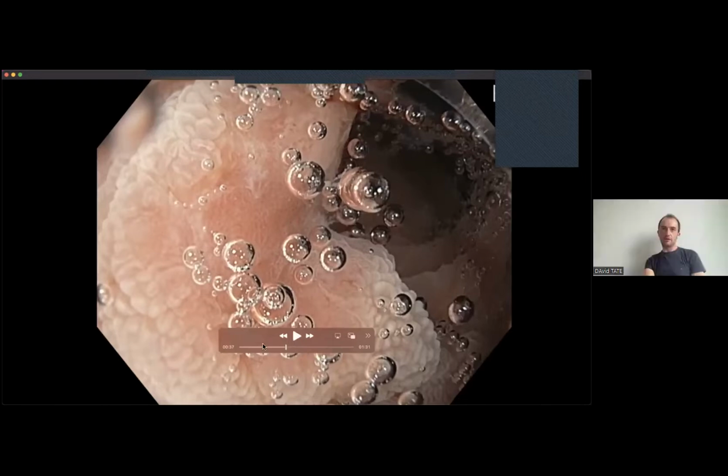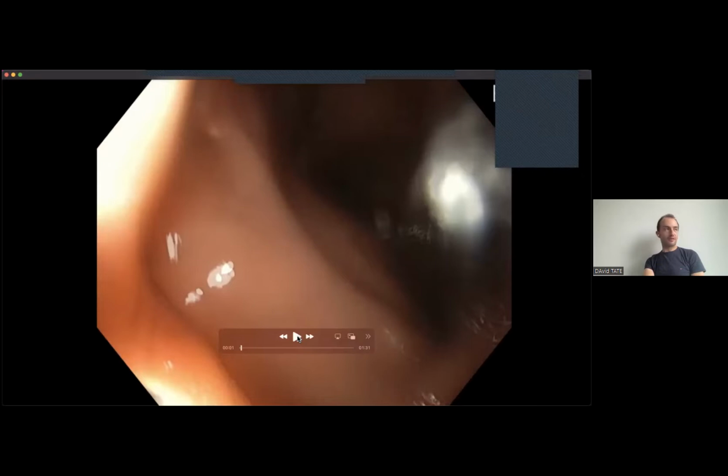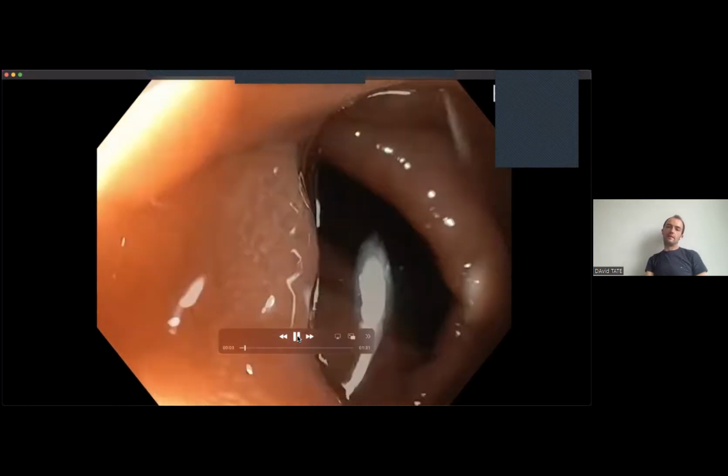Did you ever do colonoscopy at all? No, never. This is all brand new to me. This is going to be a good test then of this algorithm. So remember, let's talk about your first impression, but let's also talk about whether you can see a demarcated area in this polyp as we play the video, okay? Sure.